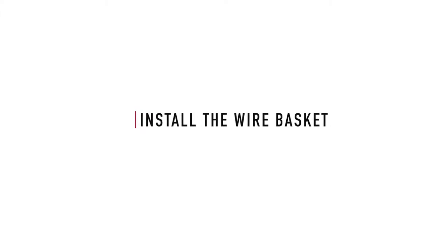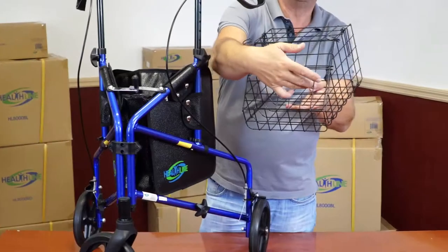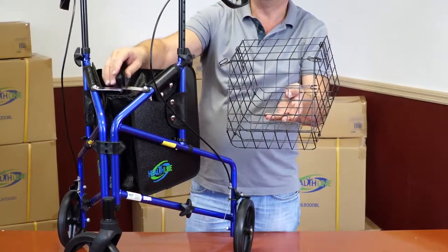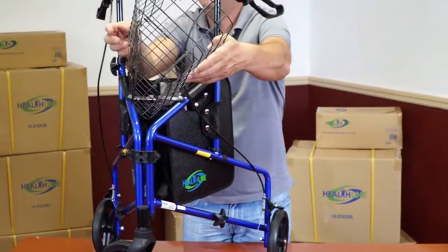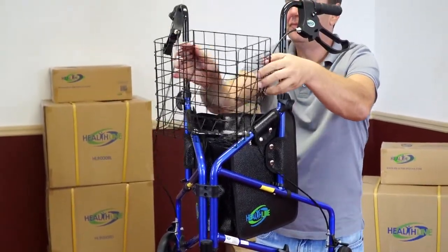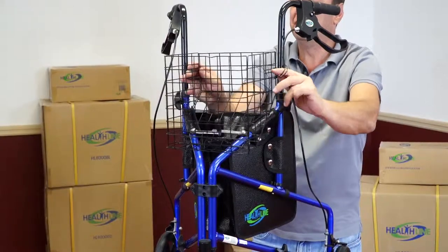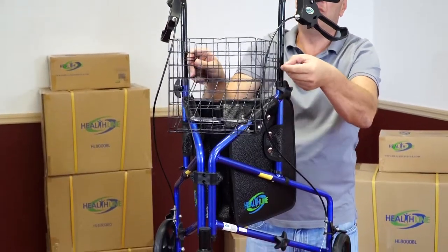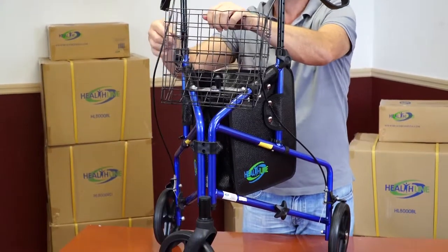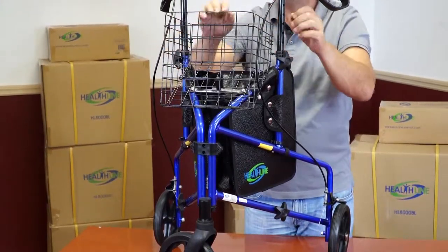Install the wire basket. Notice the opening on the bottom of the basket. Bring the wire basket to the top of the Rollator and place it between the handlebars so that the plastic knob of the security lock goes through the opening on the bottom of the basket. Fasten the basket to the handlebars with the corresponding hooks on the back of the basket. The basket is now secured.